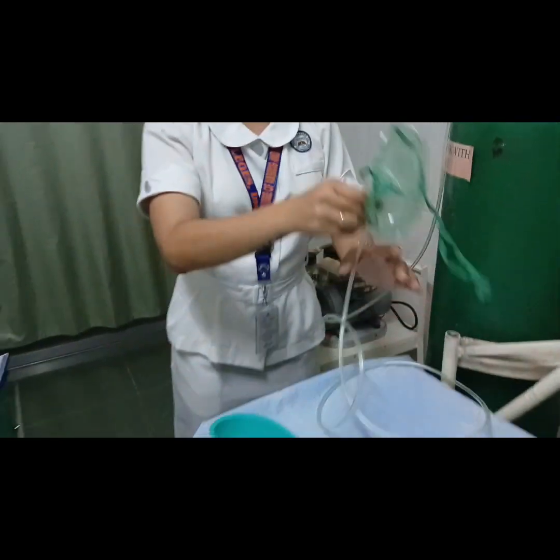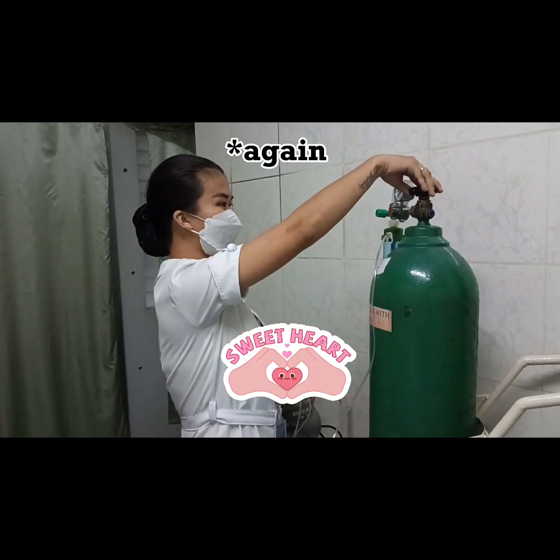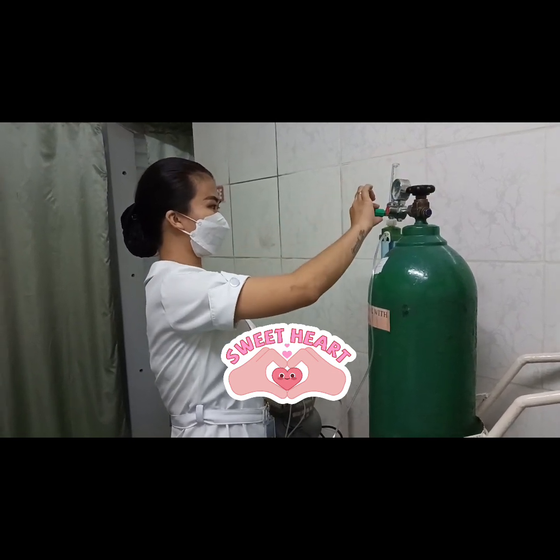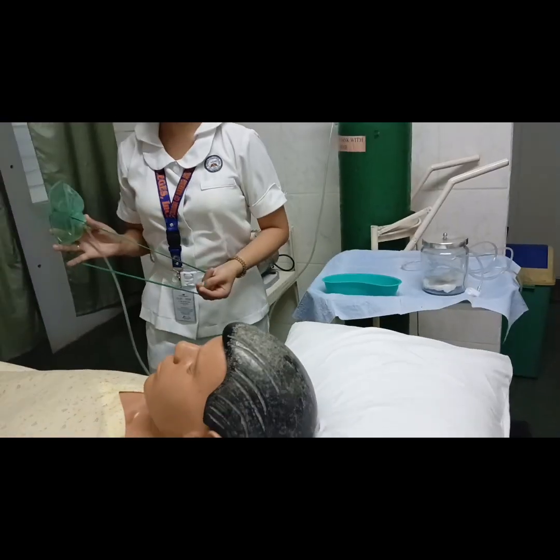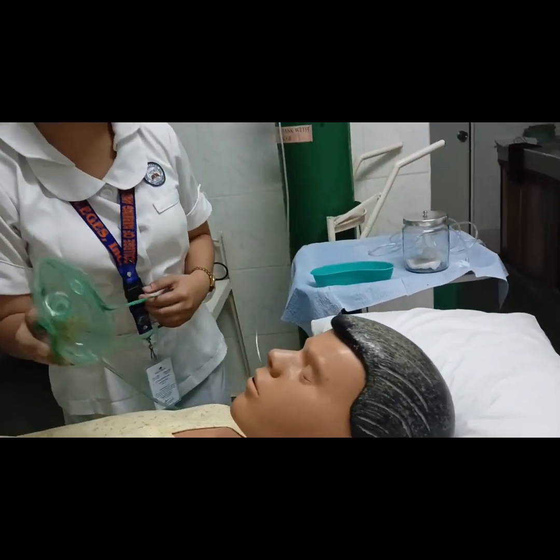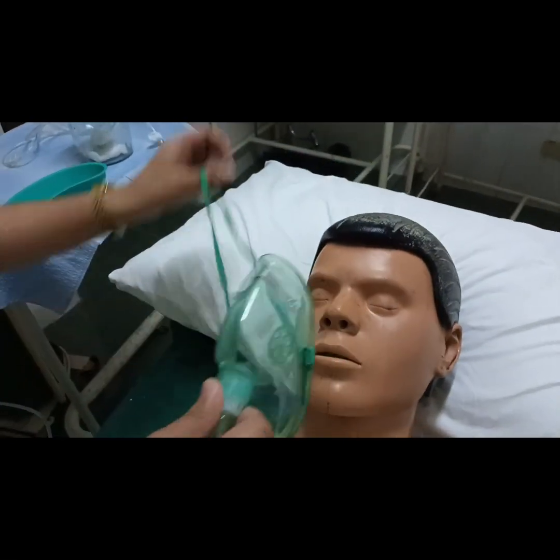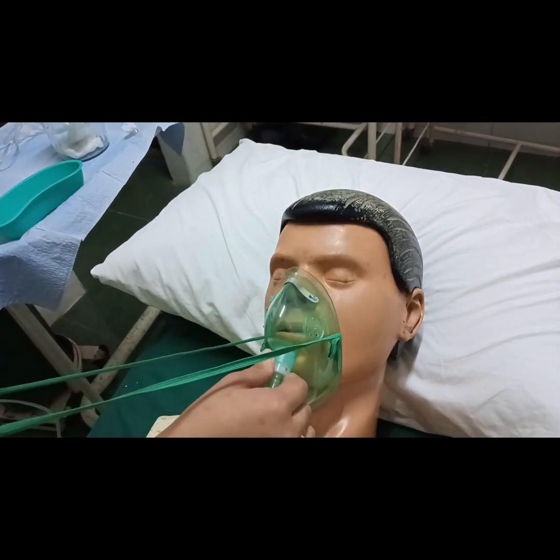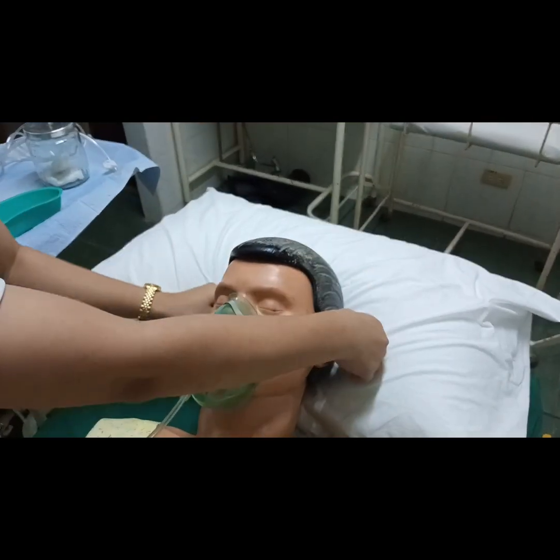For the face mask, I will turn on the oxygen flow rate until bubbling. Then I will place the mask over the patient's nose, mouth, and chin, and place the elastic band around the back of the patient's head to secure it.